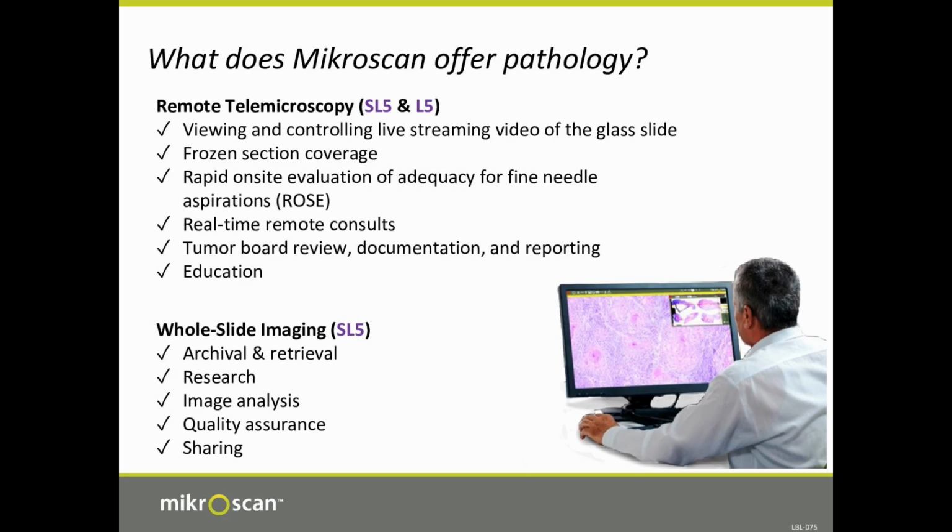So this is kind of a breakdown of why you would do telemicroscopy versus whole slide imaging. If you're doing telemicroscopy, the advantages are you can view the slide in real time, so you don't have to worry about the time it would take to scan a slide. You don't have to worry about QCing the scan or uploading the scan and managing that big digital image. As mentioned earlier, the slides are quite big.